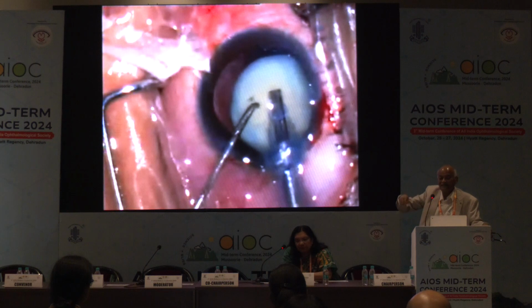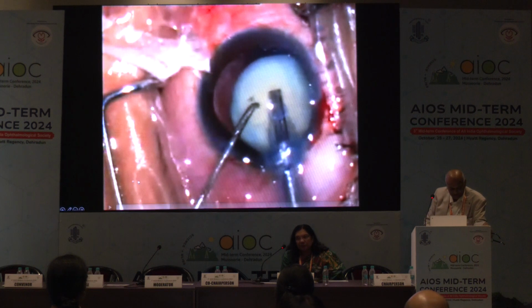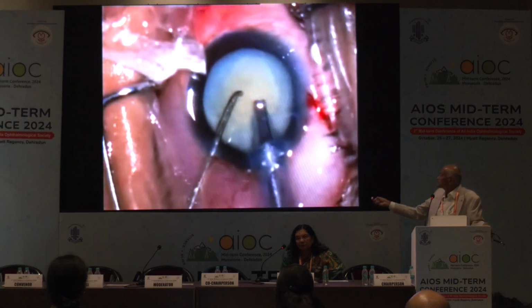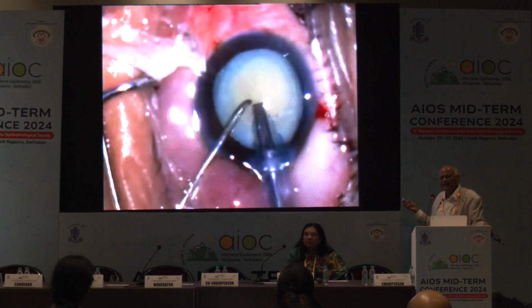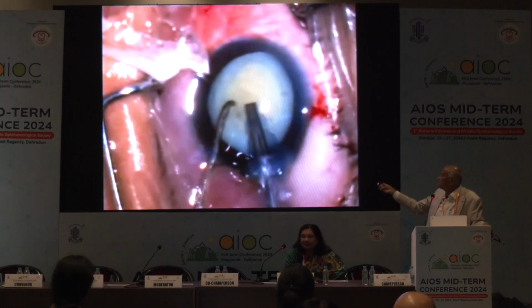Like that, here it is the stroke length of the machine. Whenever you are purchasing a machine, you must know how much the stroke length is, and that stroke length is very important. Now in this, I am doing the phacoemulsification, and the stroke length of this machine is less. I am doing upper, down, everything, but still I am unable to penetrate.